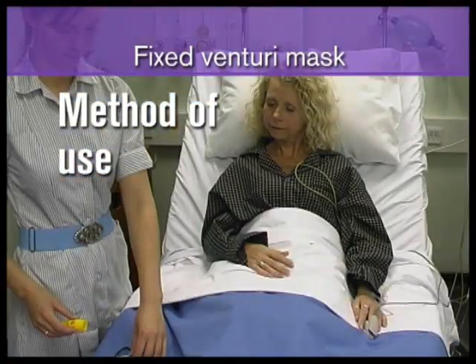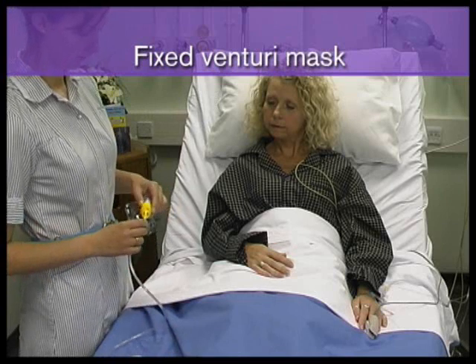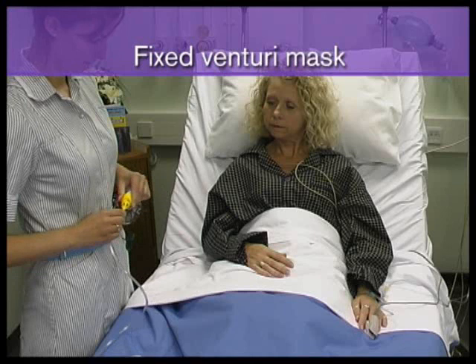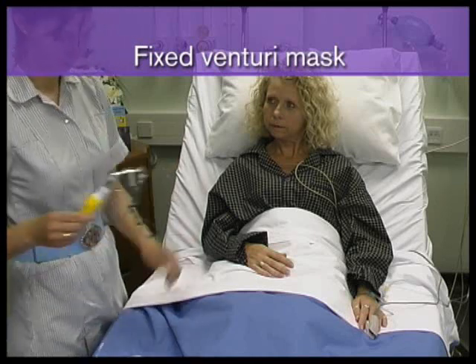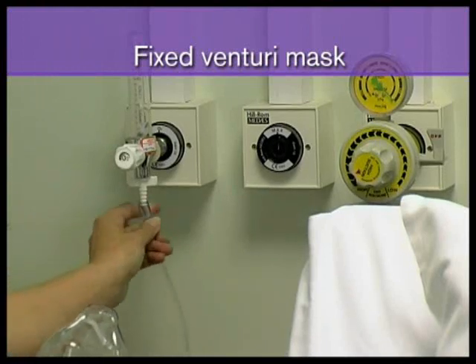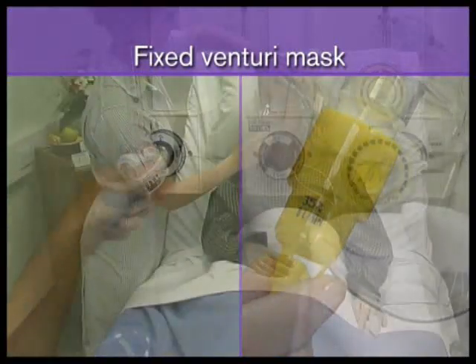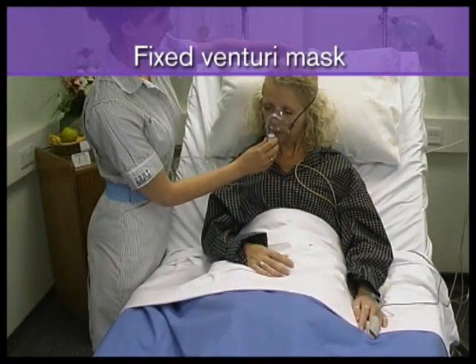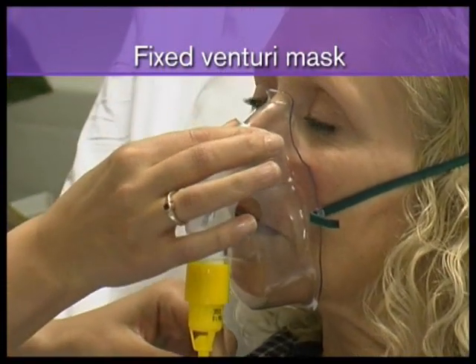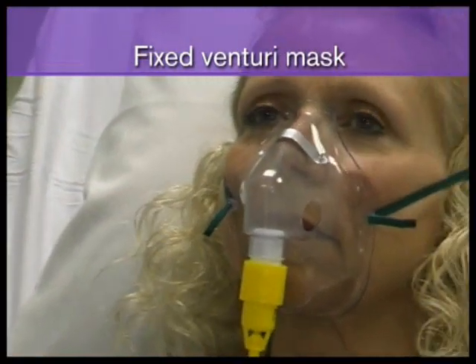When using a Venturi mask, select a Venturi valve of the prescribed oxygen concentration and attach it to the mask. Attach one end of the oxygen tubing to the valve spigot and the other end to the oxygen flow meter. Set the flow meter to the flow indicated on the valve. Place the mask over the patient's nose and mouth and tighten the elastic to obtain a secure and comfortable fit. If the mask has a nose clip, it should be pinched to provide the best possible fit.